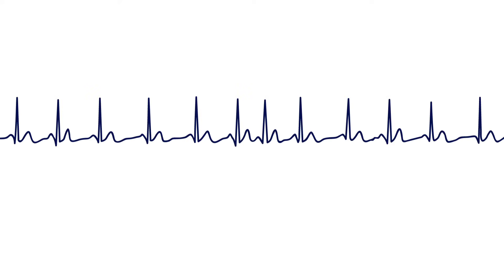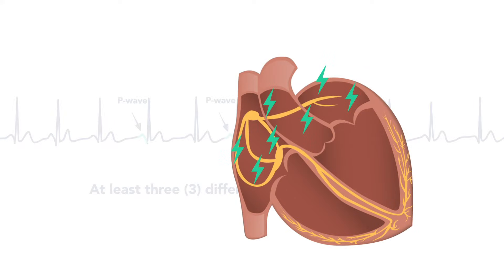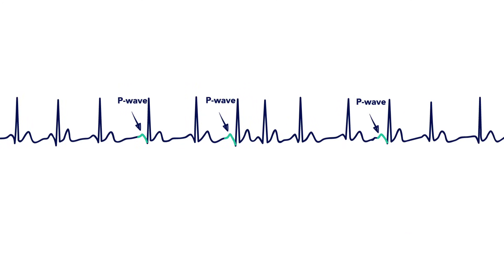Here is a rhythm strip of someone in a multifocal atrial tachycardia rhythm. You'll notice P waves which all have different shapes or morphologies. These different shapes indicate a different site of origin of electrical atrial depolarization. This is a defining characteristic of this arrhythmia.